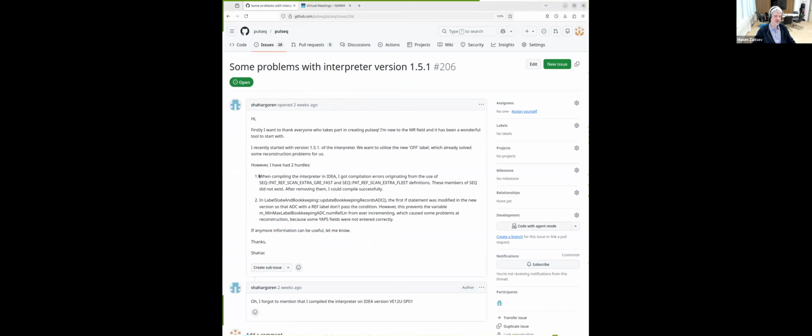We have a situation where the compilation doesn't work with these flags, and it's totally fine to just comment them out. If on your system they are not known, then just comment out the line which uses these additional flags.